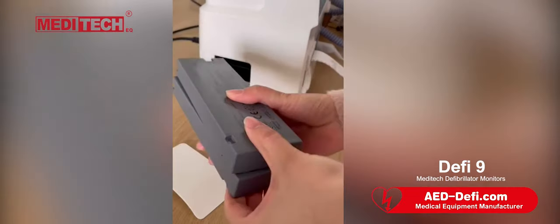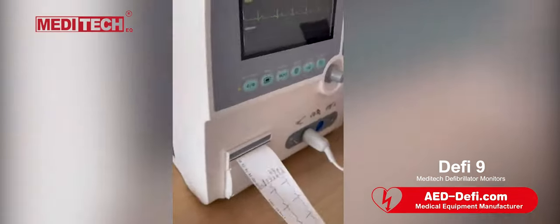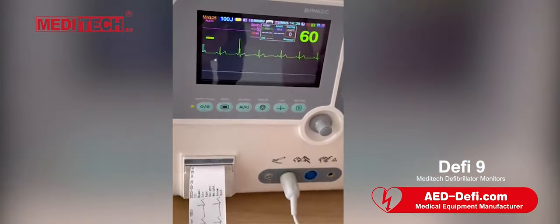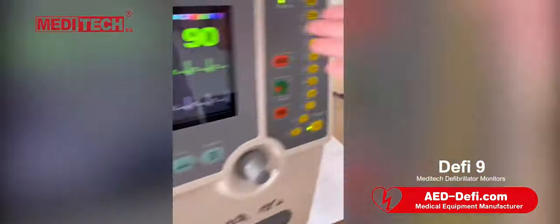Put these two batteries here. This is the cover. This machine can optionally have AED like this.